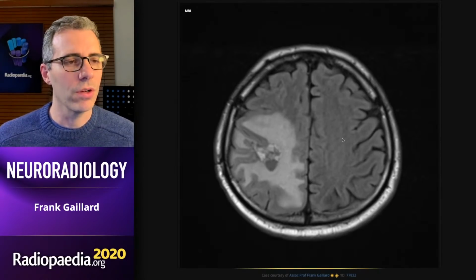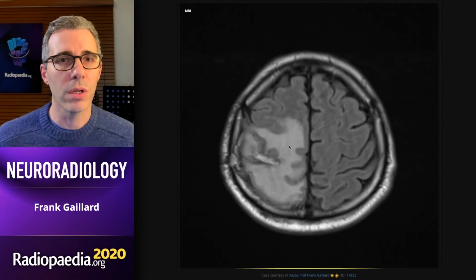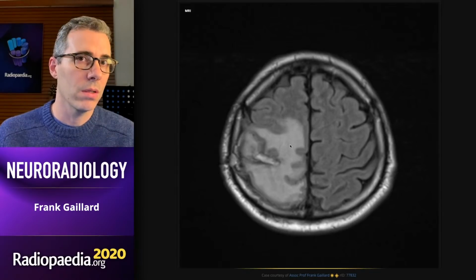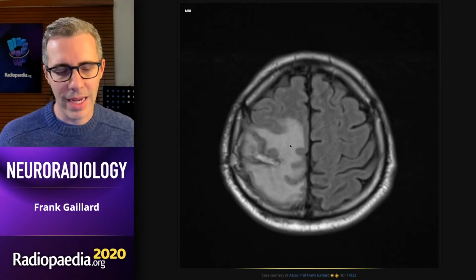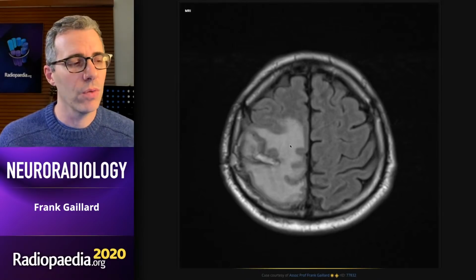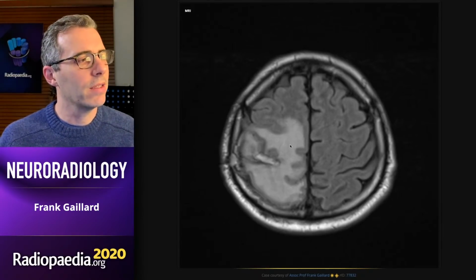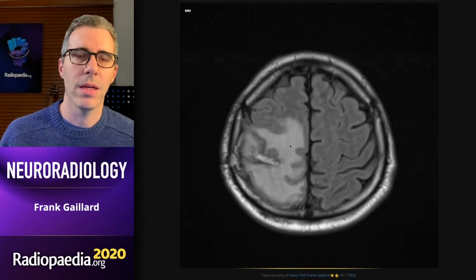Assuming you don't have that, and you don't often have that sort of clinical information, what are we going to base it on? Well, you're going to look at FLAIR and T2 for edema. And again, you're going to try and distinguish between tumor and just vasogenic edema. Because the reason pseudo-progression occurs is that you get florid breakdown of the blood-brain barrier with lots of fluid overcoming the brain's ability to clear it. So you get accumulations of vasogenic edema. And the blood-brain barrier is also what keeps gadolinium out, so that will also leak in and you get enhancement.